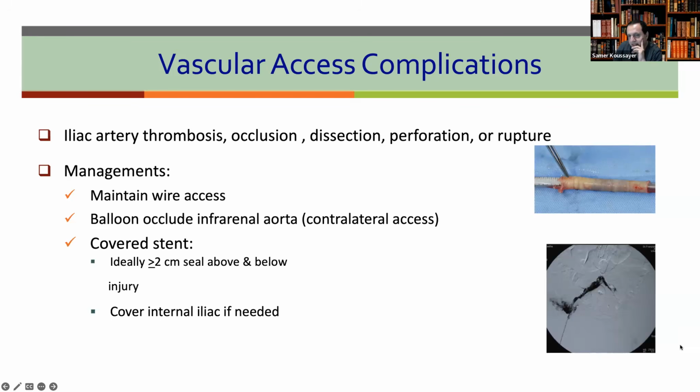And don't worry about the internal iliac. If you need to cover it because you need more landing zone, this is an emergency, so cover the internal iliac. Don't worry about it. Now your priority is to seal the bleeding.